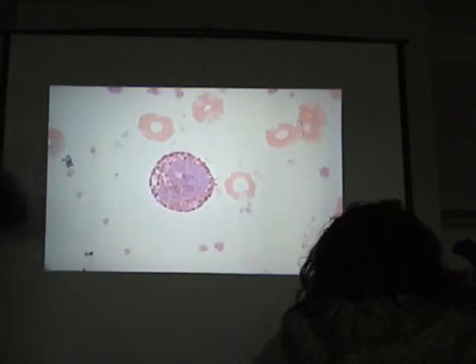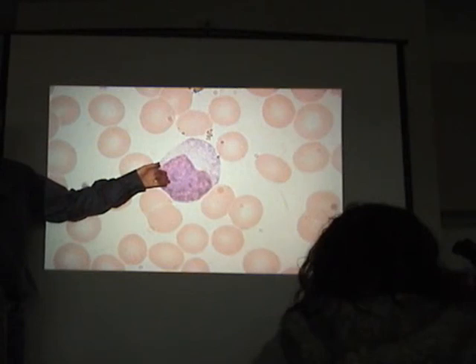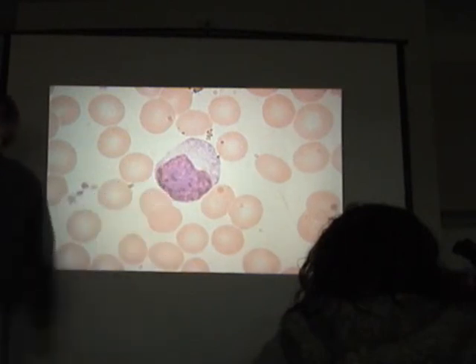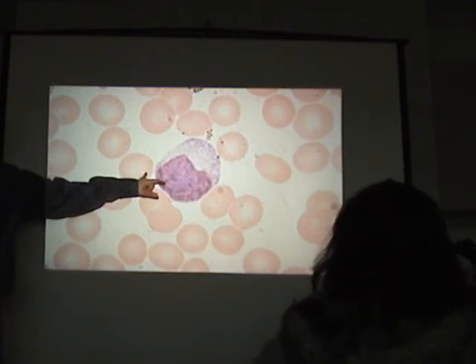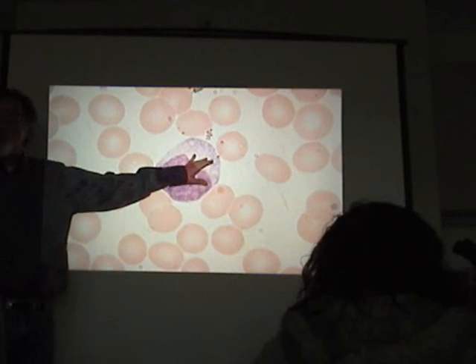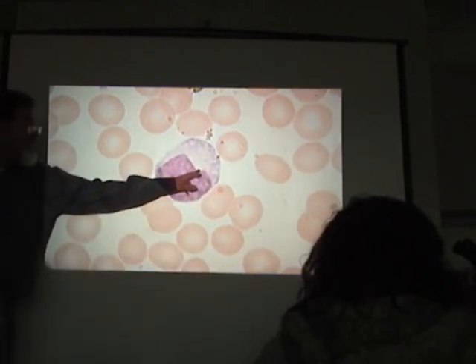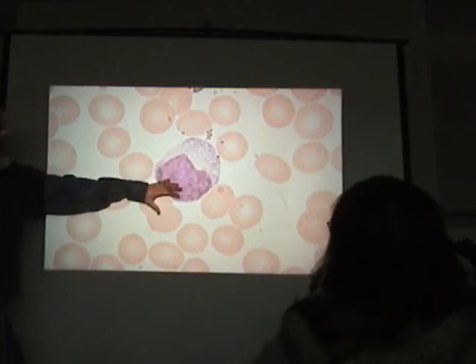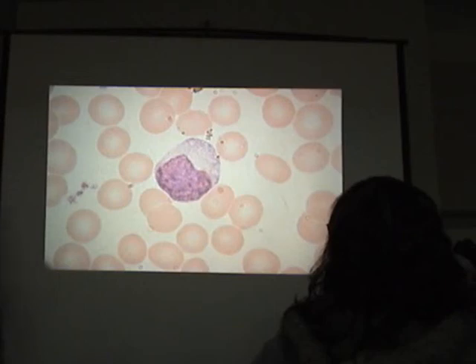All right? That leaves us with monocytes. Look at the size of this cell. The nucleus alone looks to be a little bigger than this red blood cell here. So you keep size in mind. Nothing really happening granule-wise. The nucleus can be large and eccentric, which means it's oriented to one side of the cell, and oftentimes has an indentation, or is kidney shaped. Monocytes.